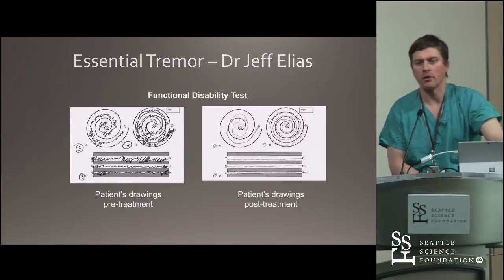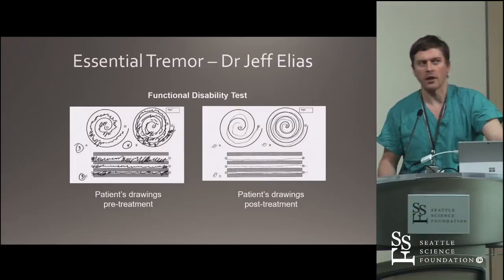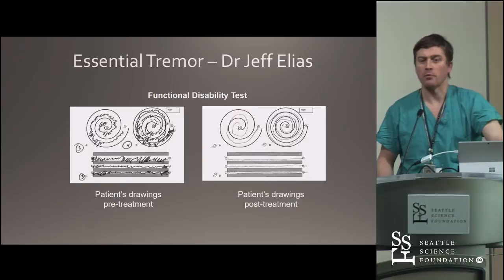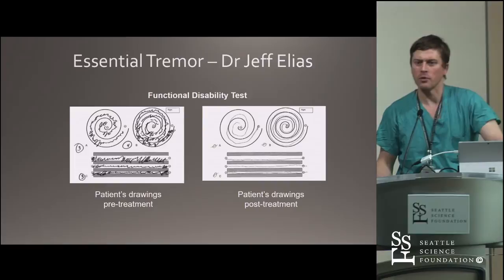Clinically, this is what we did with the patients, both intraoperatively and postoperatively. So they have a preoperative test where they have to do spirals, and then they do this while in the magnet, and this is what we use to figure out whether we've got adequate treatment effect. While the patient's in the magnet awake, they have a pair of prism glasses because they need to be able to see down their chest because they're lying back in the MRI. And then they do these spirals and the straight lines, and that tells us whether we've got adequate treatment effect, as well as the temperature rise that we see in the thalamus. We can monitor the temperature using MRI.